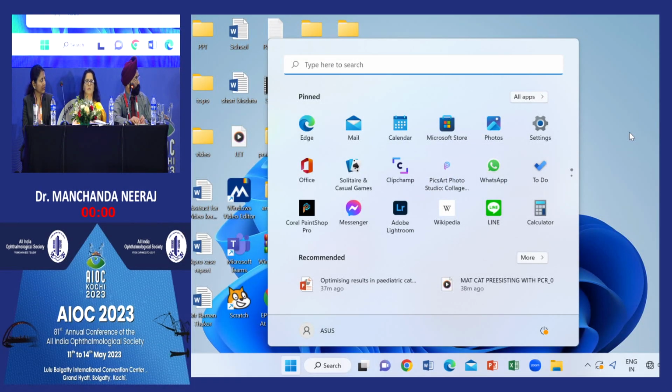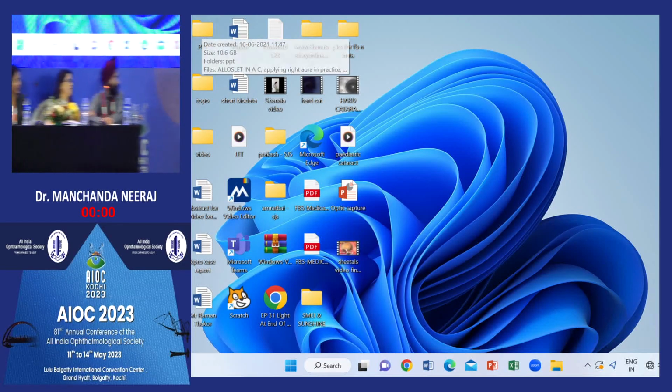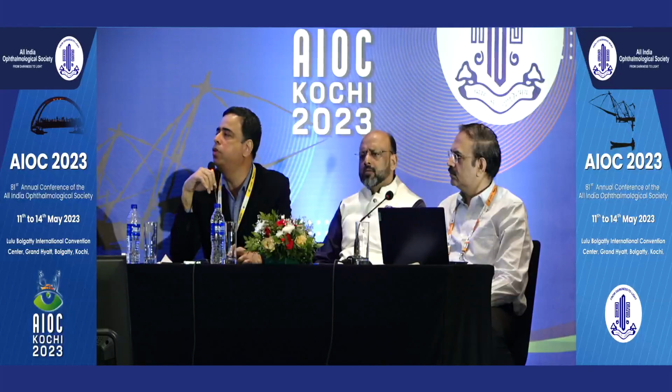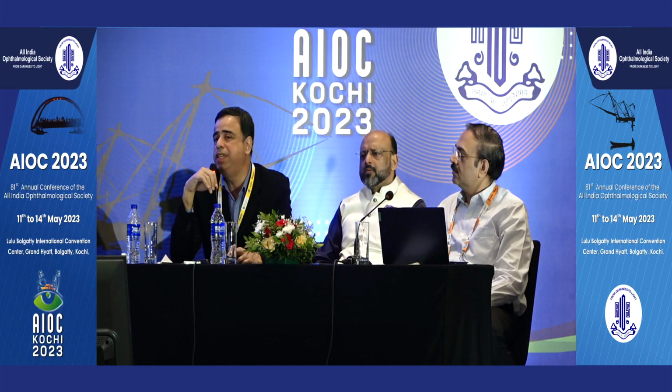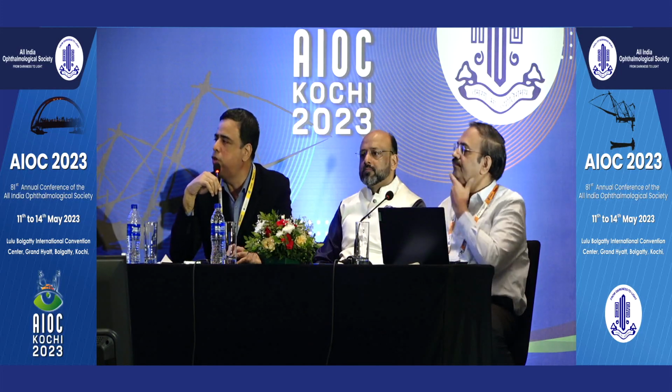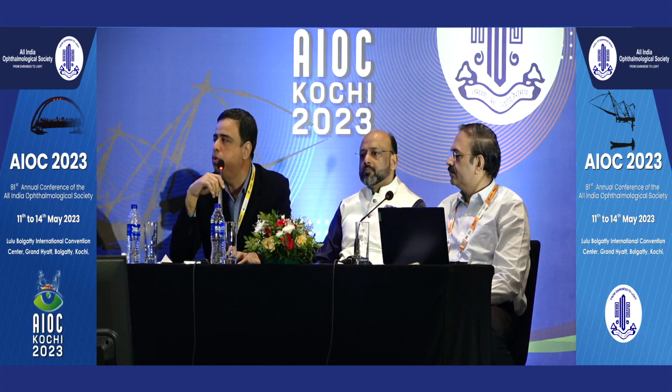Definitely. I generally do not use triamcinolone because, myself being a retina surgeon, I can clearly visualize. But if required, triamcinolone is one of the methods you can use to see that the anterior vitrectomy has been done completely. So that is the end point, just to check, like I told the few points: the pupil should well constrict, there should be no tags. To visualize it better, triamcinolone definitely can be used, but I rarely use it.